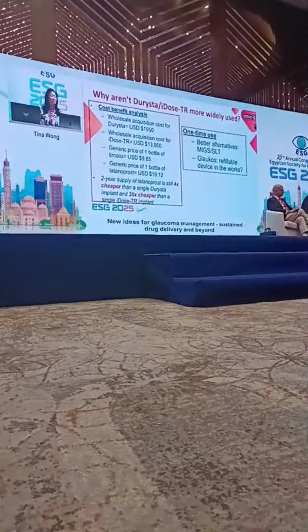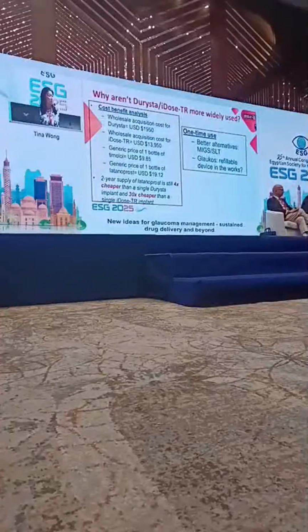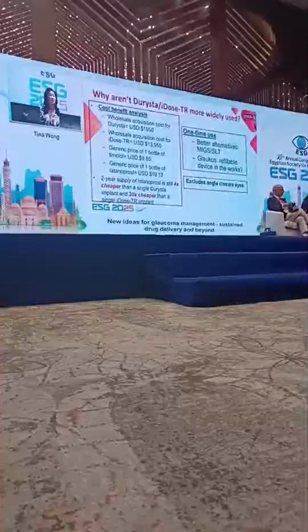Moreover, one-time use is not very attractive to our patients who have chronic glaucoma. There probably are better alternatives like MIGS and SLT out there. Glaukos is trying to address this by having a refillable device. Will it work? Will it be adopted? We don't know yet.